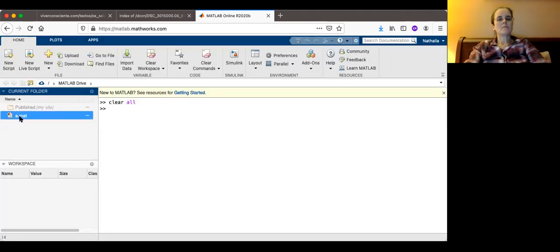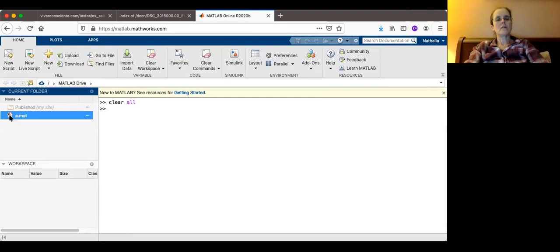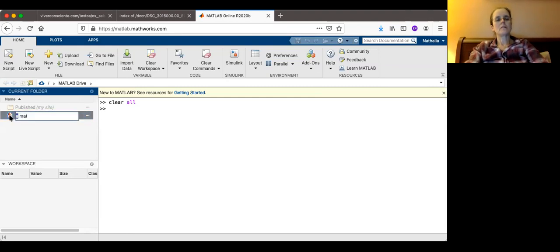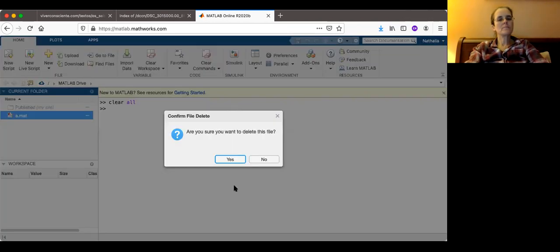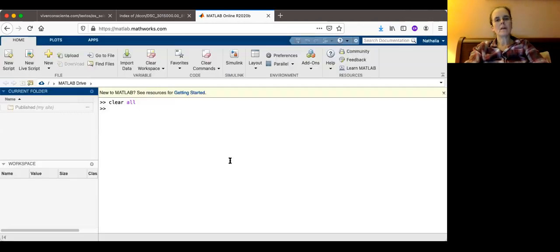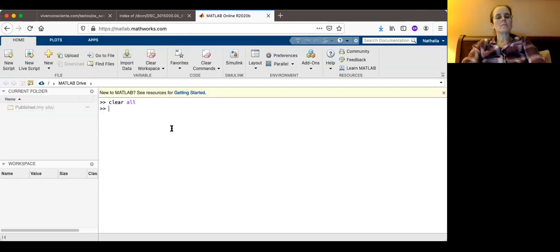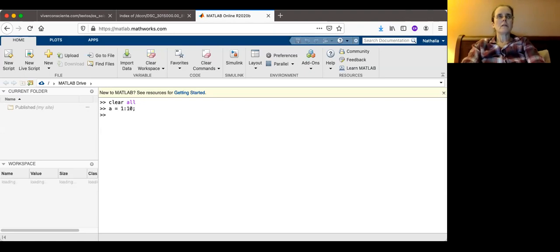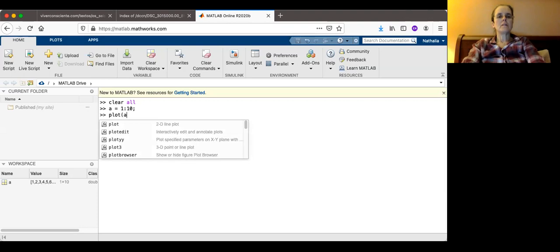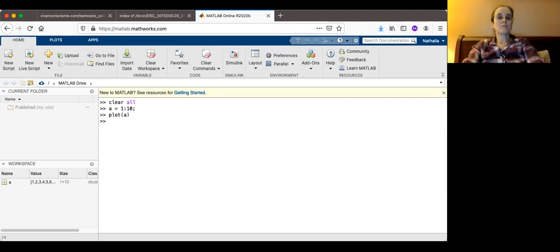I'm going to delete this guy. So right click. I'm trying to right click. Delete. And now I'm going to give you an example. A equals 1 to 10. And then I'm going to plot A. And there should be a figure showing up.